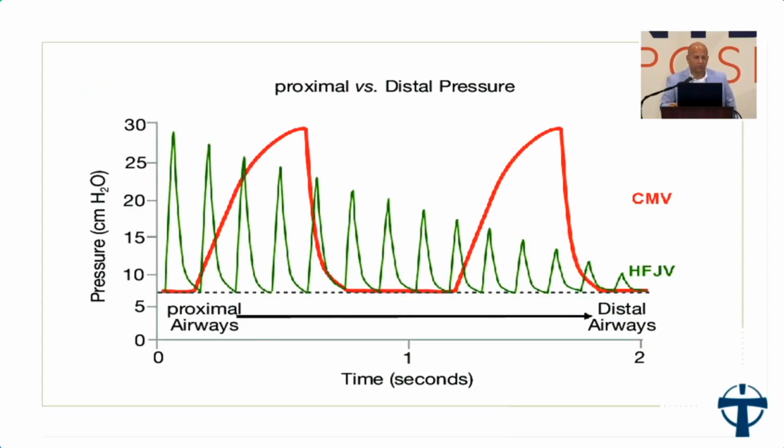These are used in tandem with a conventional ventilator. A conventional ventilator sets a rate of about 6, depending on what you like. And that is basically just a sigh breath to help blow off more CO2, and again, a little bit of chest rise too. So you can see as the high pressure starts, and as the airways get narrow, like from the bronchus to the bronchioles, which I said a minute ago seemed kind of boring, that pressure just tends to drop. What it does is it doesn't cause any further barotrauma to the lungs. That's the great thing about this ventilator. If it's used properly, it's good for your patient's lungs.